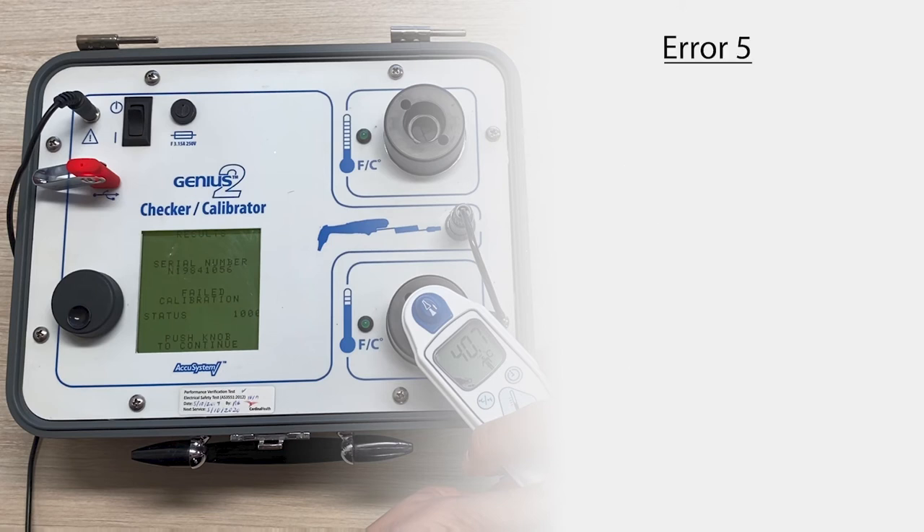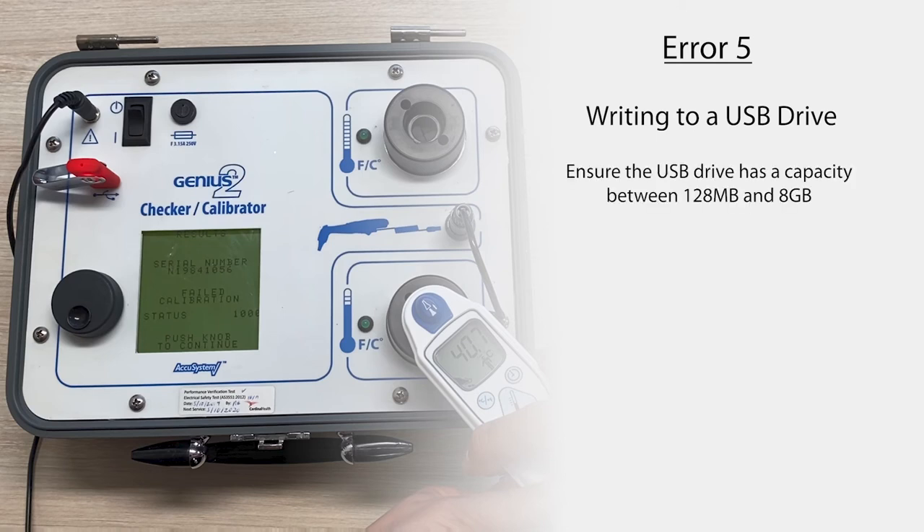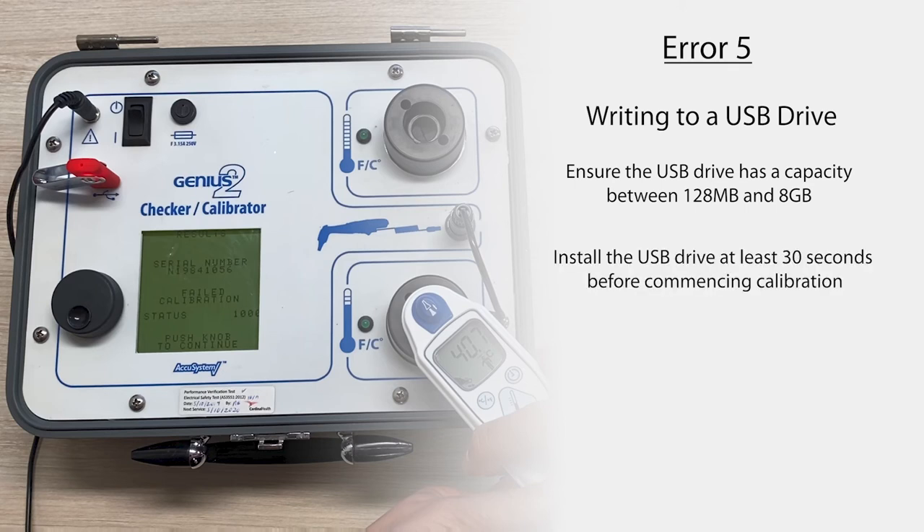If you're getting error 5, which is the error when you try to write to a USB drive, ensure the USB drive has a capacity between 128 megabytes and 8 gigabytes and is not full or write protected. Make sure to install the USB drive at least 30 seconds before you commence and make sure it's flashing before attempting to write on it. For best results, have the USB device plugged in before powering on the calibrator. If neither of these work, try switching the calibrator off and on quickly — you can bypass the 15-minute timer if the calibrator was already warmed up.